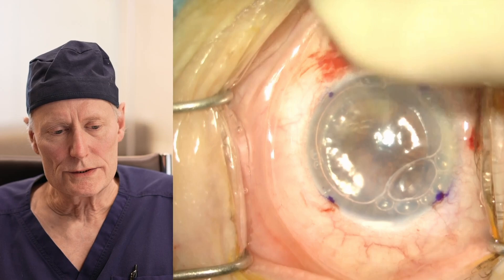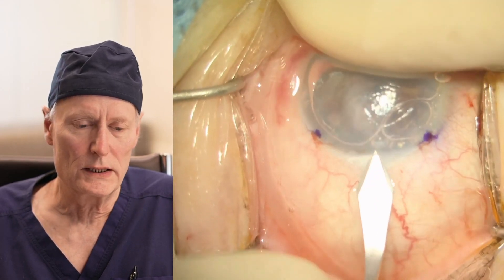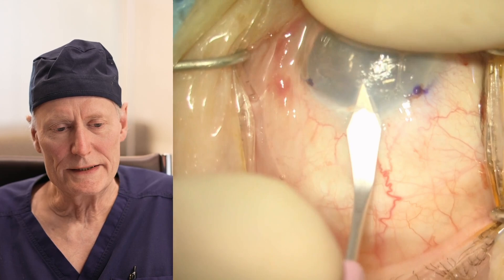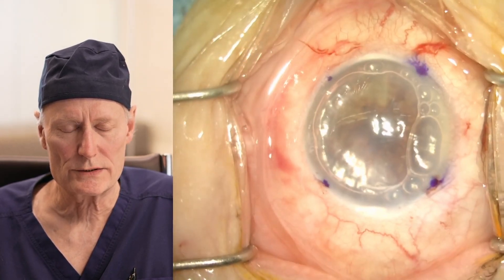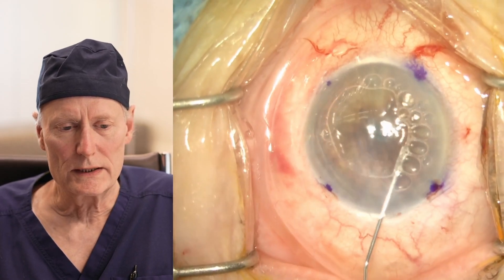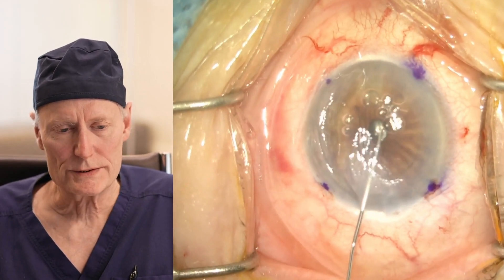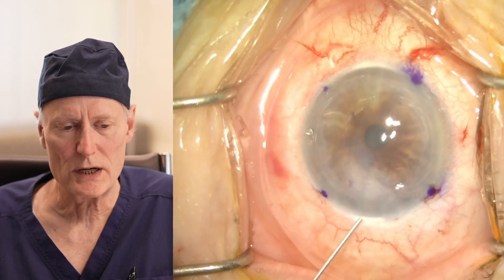Now we're going to make another little incision. This is another blade used in cataract surgery — the same size incision, 2.4 millimeters. And we're going to get rid of the air bubbles now, just replacing the air in the front part of the eye with some salt water.